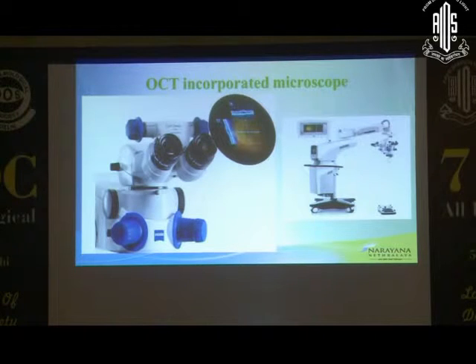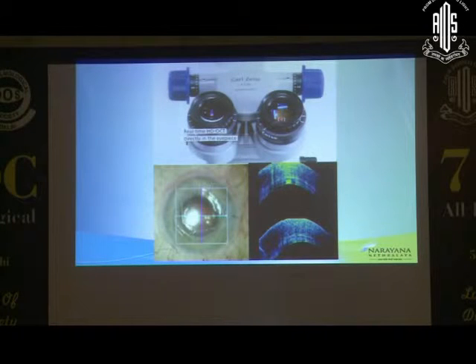Now recently we've got the OCT incorporation in the microscope itself, which can give us the gauge of the depth, and this is the surgeon's view as to how it can be seen. The surgeon sees the partial thickness or the profile view of the cornea, and that's an advantage, and this is how it appears.